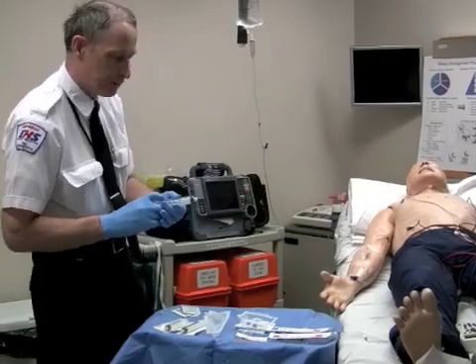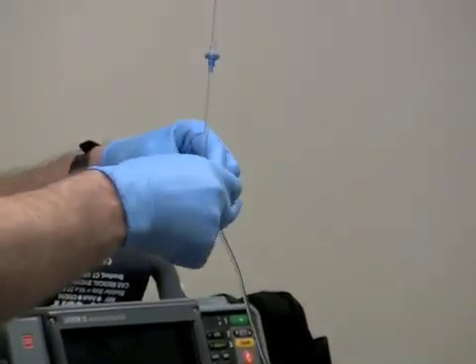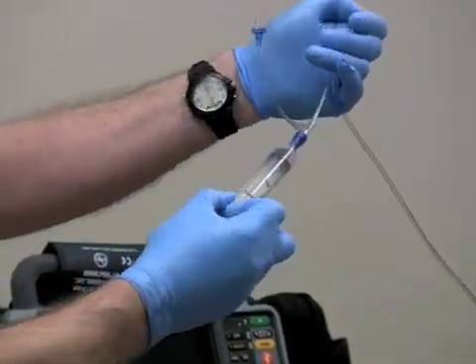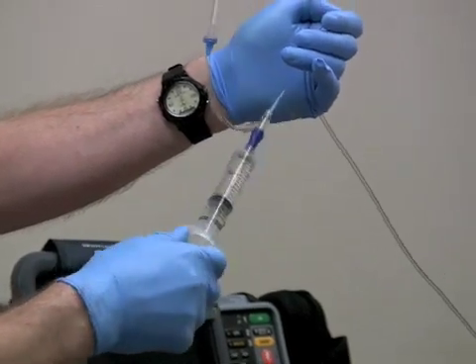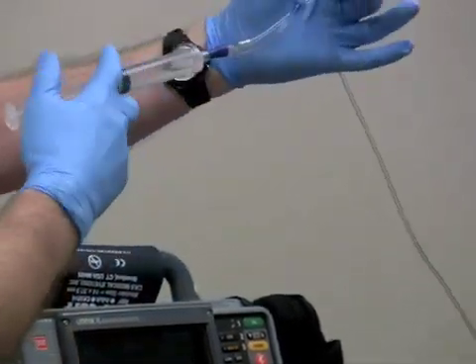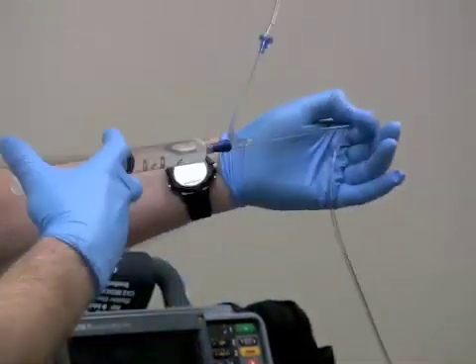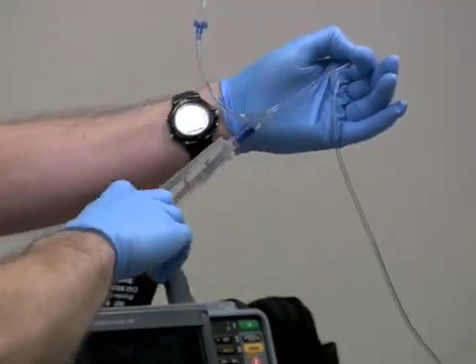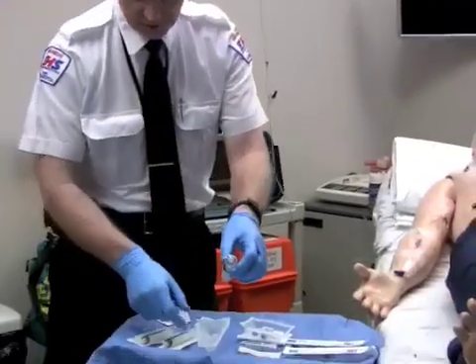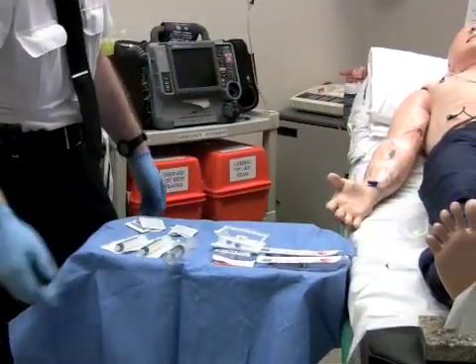Your 20cc syringe will draw saline. Lock that off so that you are not sucking the patient clear of blood, and then just pull 20cc of flush saline. Keep on this so that when you press it in, the one-way valve is tested for back flow — and I don't get any back flow. Then remove this and maintain aseptic procedure; don't touch that.